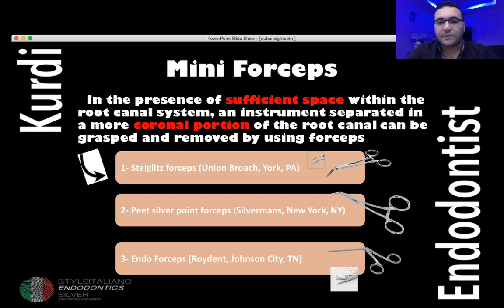We have Stiglitz forceps, as I said. We have endo forceps also from Roydent that you can use.